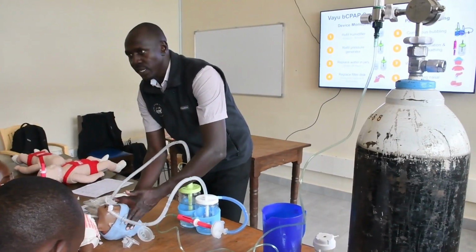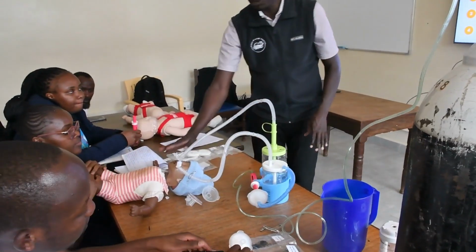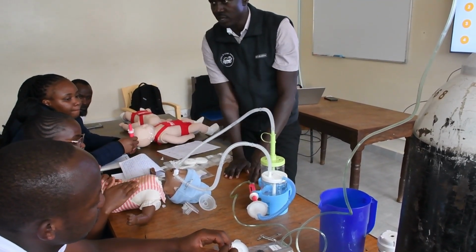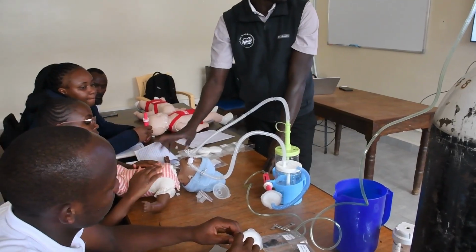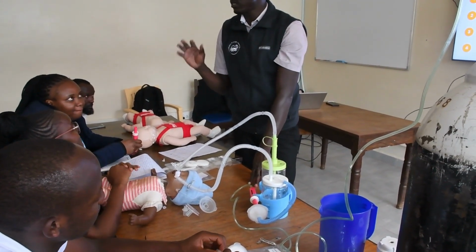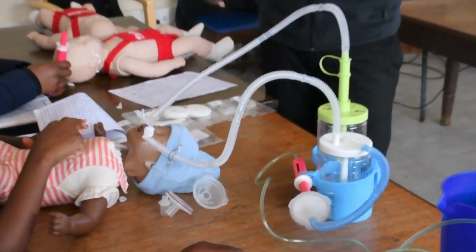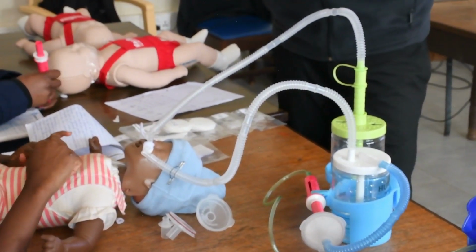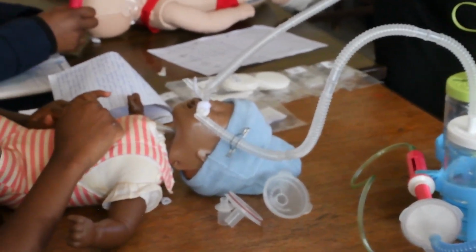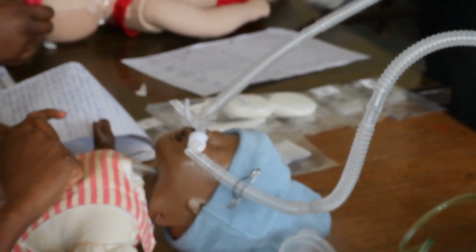Then coming to the patient monitoring. Patient monitoring is also connected to the device monitoring. Work of breathing: what is going on with work of breathing? Is the patient still having work of breathing? Nasal flaring, lower chest wall drawing, grunting, intercostal recession. Is your baby still having severe work of breathing?